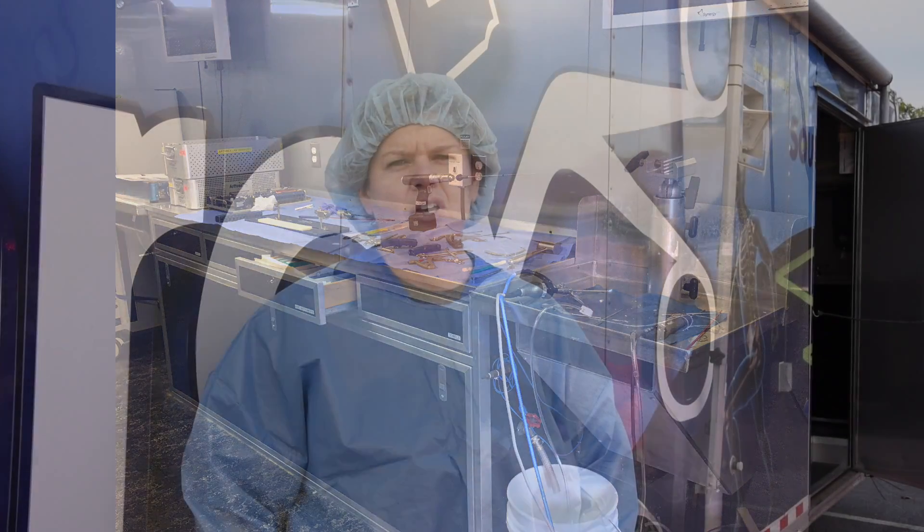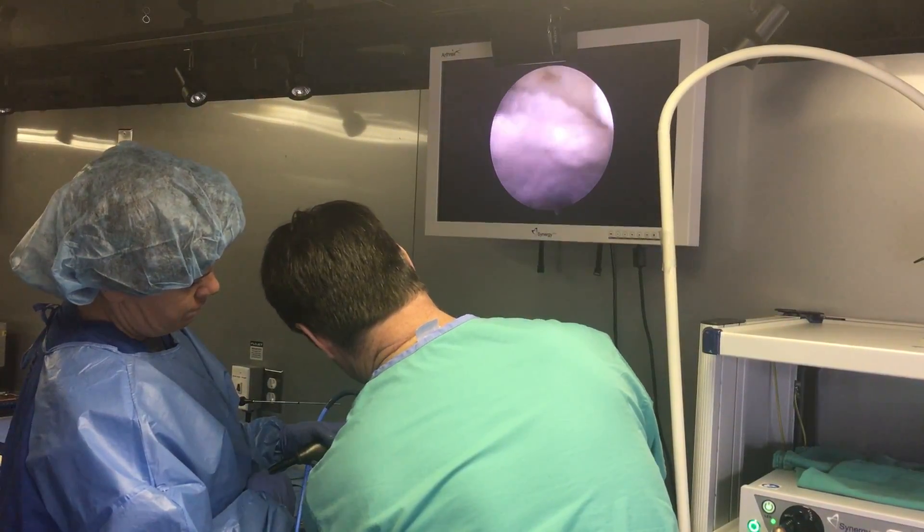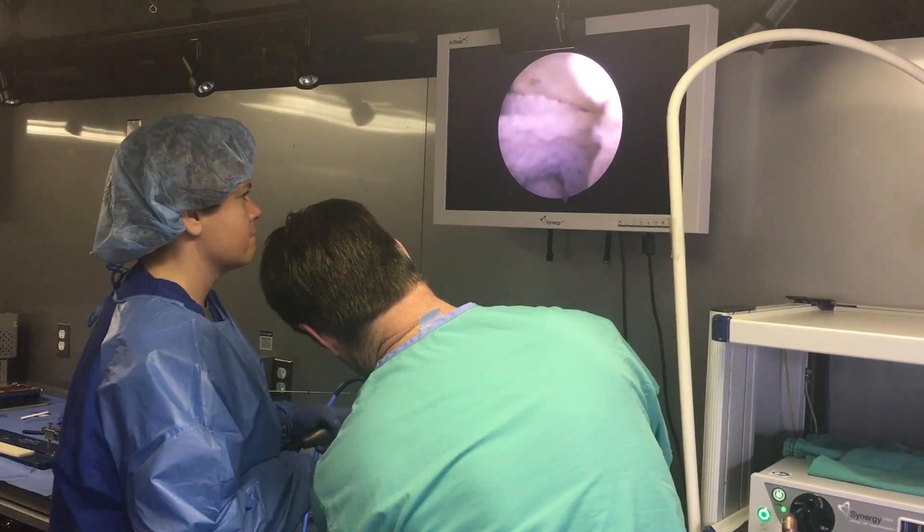Today we're doing a lab using cadavers for a shoulder and a knee, and for the knee so far we've done an all-inside technique for ACL reconstruction. This is really important for all of our sports injuries that we have here on base.